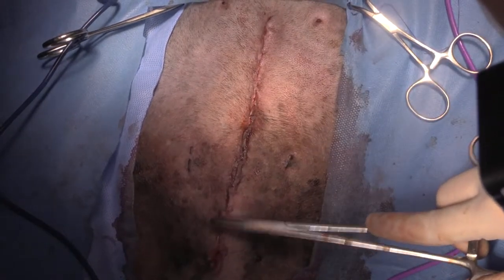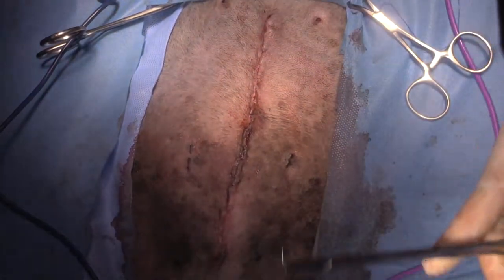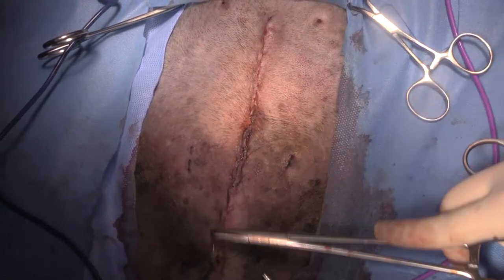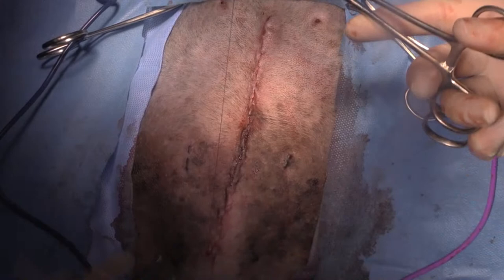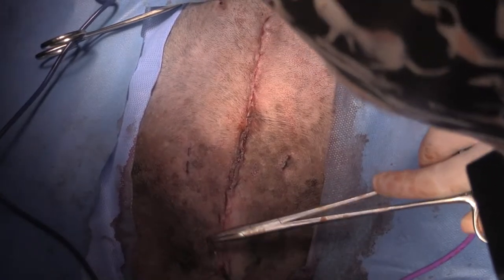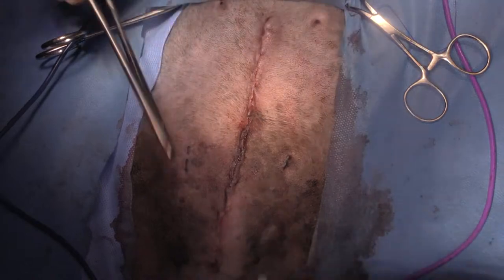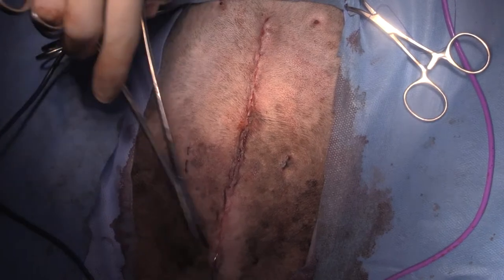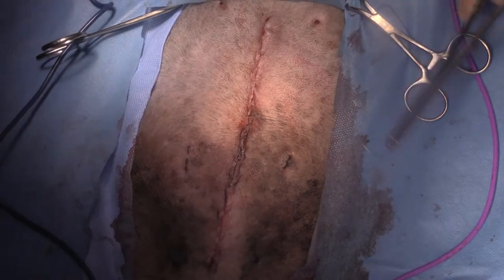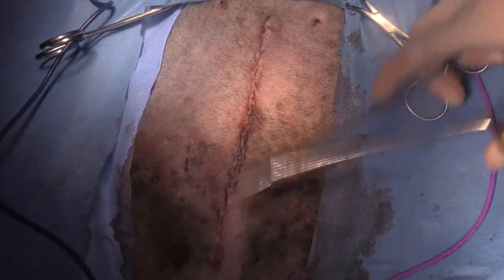So this is with a mucocele, everything's quite thick with that material inside. So we might get a little bit of ooze of some of the liquid contents, but again, we've packed it off to begin with, for one of those reasons, and two, the small amount that'll come out shouldn't cause that much concern. And we would in that case then flush the abdomen to remove as many of the bile salts as we could. And again, we probably would still not place a drain in that case. We would just make sure that the abdomen was flushed before closure. I'm just coming back and going to actually bury this knot nicely.